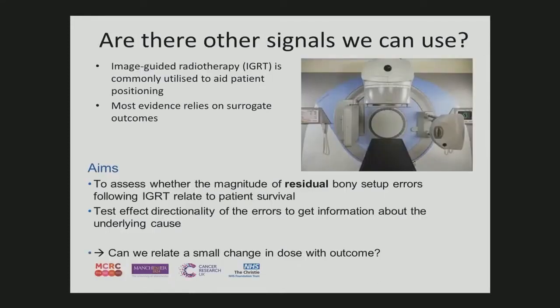So are there other signals that we can use? Just time is all right. So image-guided radiotherapy I told about, that's good. One of my students that I inherited from another supervisor who retired, she was going to look at the effect of setup errors, small treatment errors, on outcome. And I told her, well, I don't think that you're going to find anything, because the treatments are incredibly accurate.